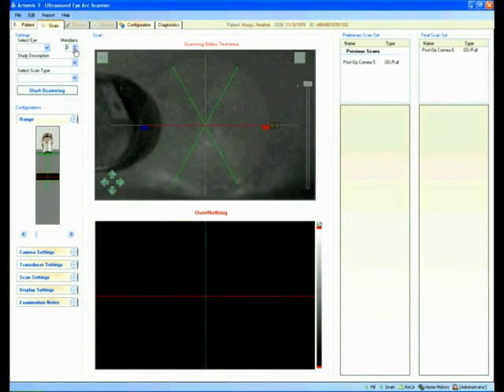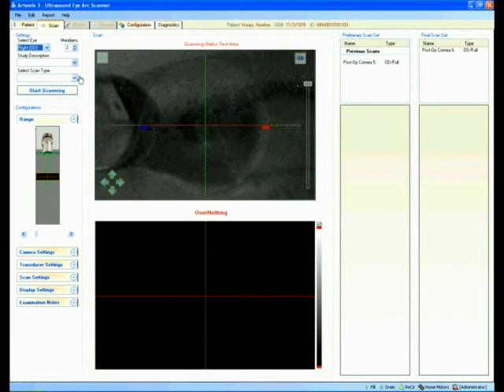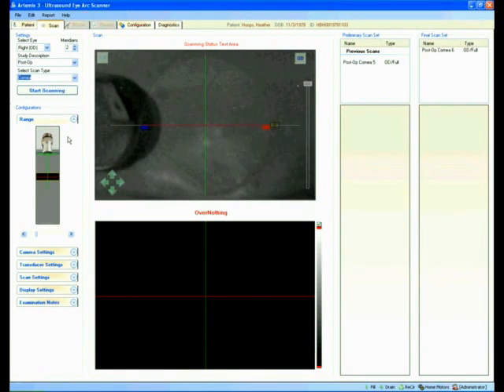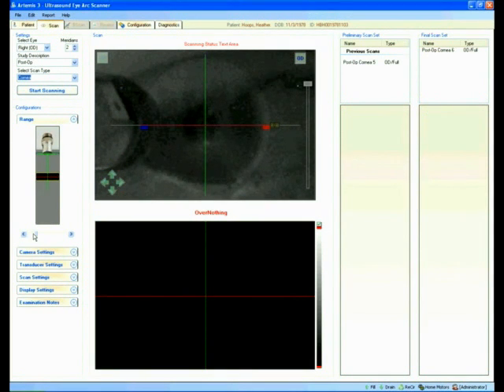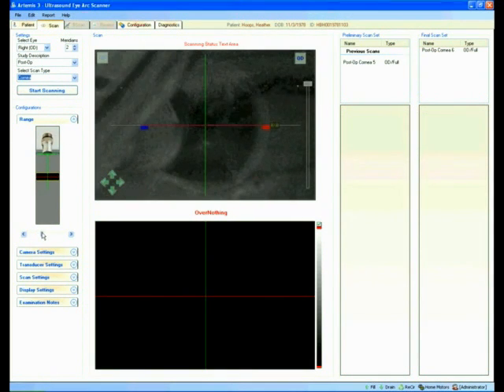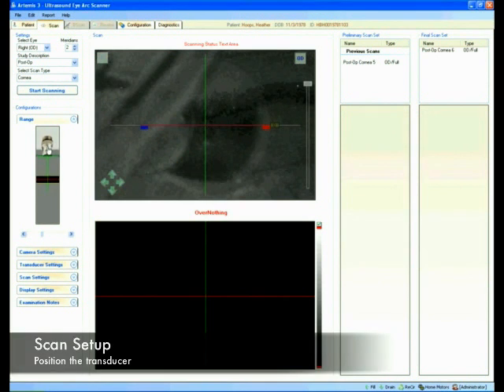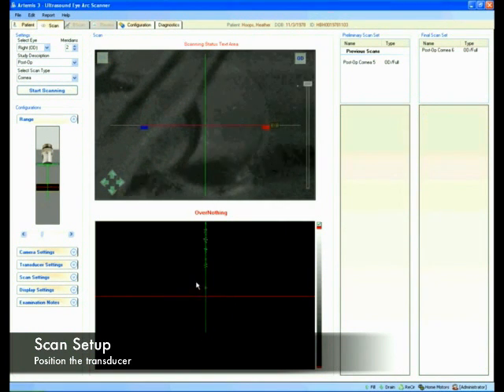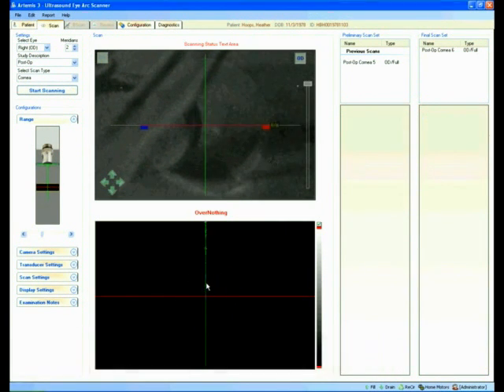Now I can center the eye and I'm going to configure the scan. We're doing the right eye, and we're doing a cornea scan. I'm going to move the transducer out so I can see an echo from the eye, and then move it a little bit closer towards the eye. When she blinks, I can see the front of the eye. What I'm looking at is the front of the cornea, the back of the cornea, and Bowman's interface.